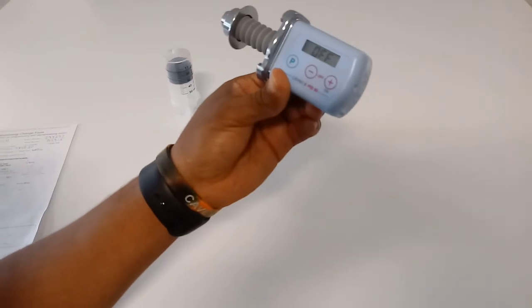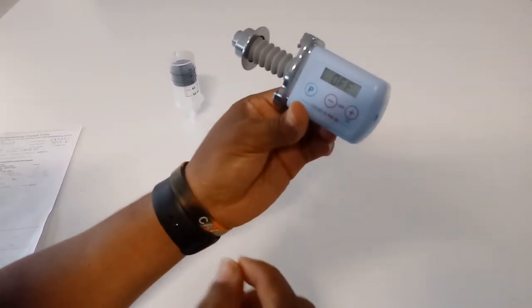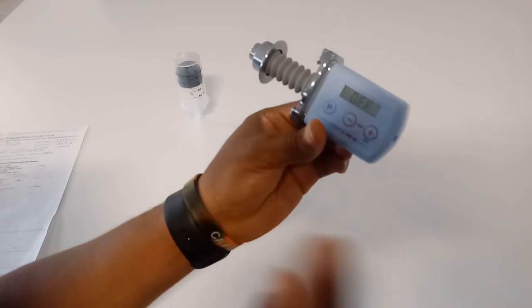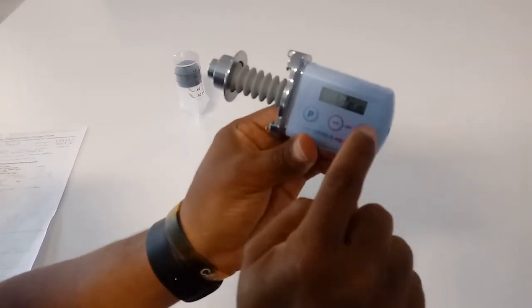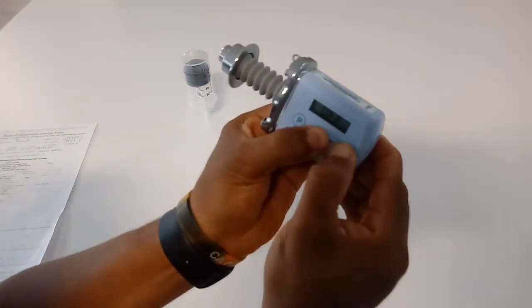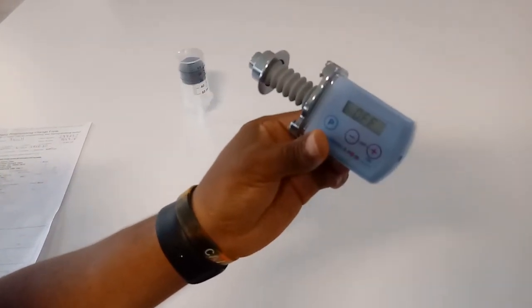Remember, our patient is going to get 12 cc's and it has to go over 10 hours. So when we turn the pump on, we'll see our volume followed by our time. That's what we should see. We should see 12 cc's, we should see 10 hours. So let's turn the pump on and see. If we did it right, 12 cc's followed by 10 hours. That's correct. So now you can turn the pump off, because if you don't, it will start to extend out. So our pump has been programmed.